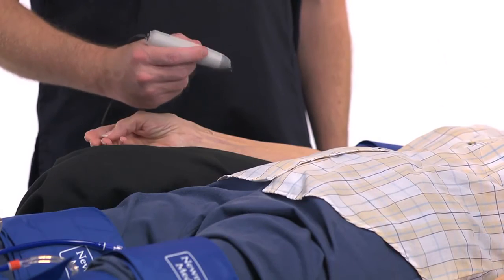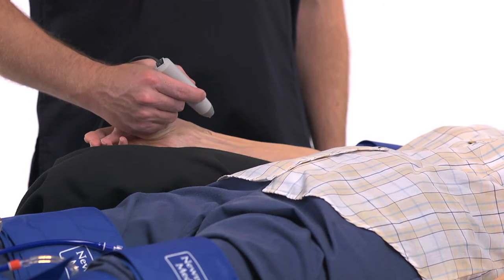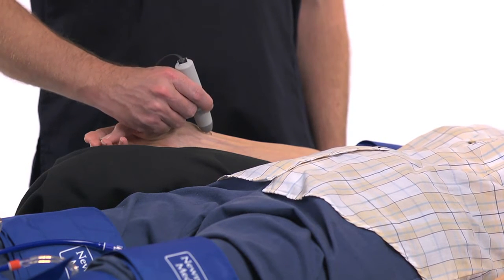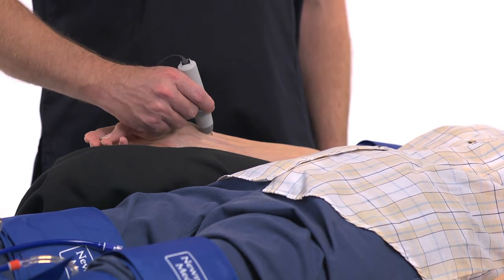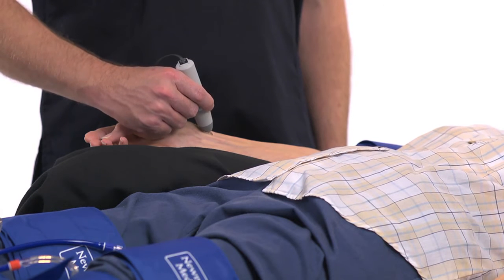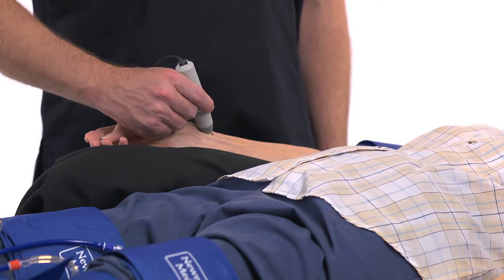Correct use of the Doppler is critical to accurate results for ABI and segmental tests. It may take practice to become comfortable using the Doppler, but you will soon gain confidence. Start by holding the probe like a writing pen. It helps to rest your hand on the patient's limb to steady the probe. With any Doppler probe, use plenty of gel. Hold the probe at a 45-degree angle to the skin for the best sound.